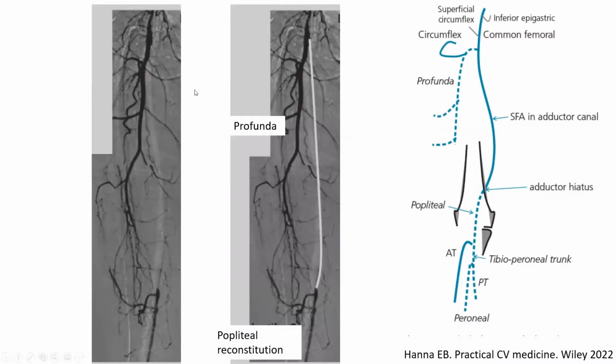A little more anatomy illustration. So this is an illustration of the femoral artery. This is a femoral angiography. This is the common femoral here, and you see filling of a vessel. Then again, late distal filling, late distal reconstitution. You should realize that this is not an SFA. The SFA is missing. And if you didn't know that, you will at least recognize it by the fact that there is late distal filling. And here I'm tracing for you where the SFA would be.